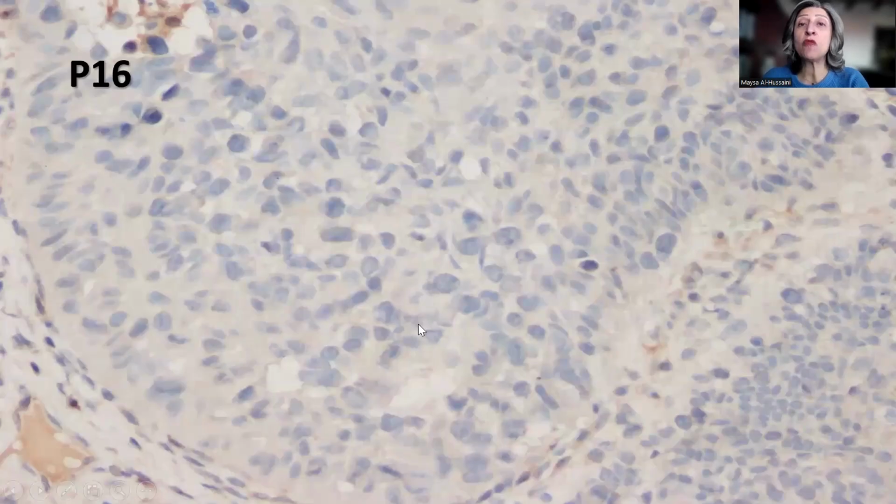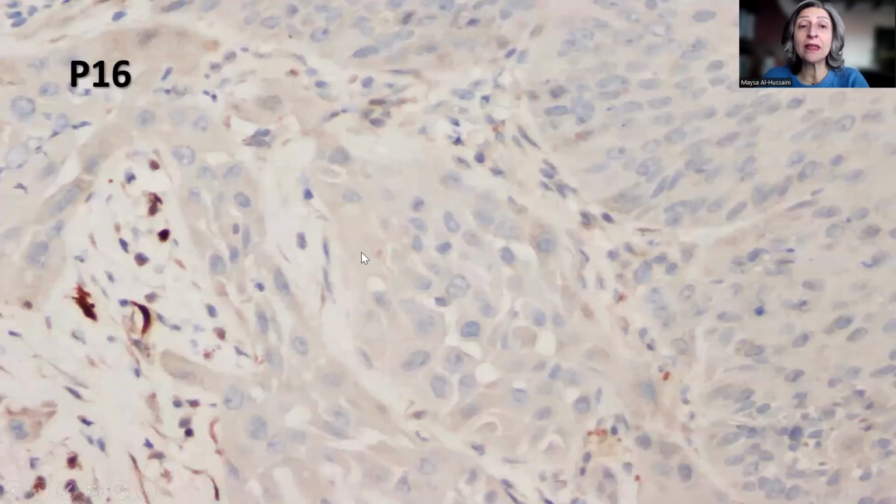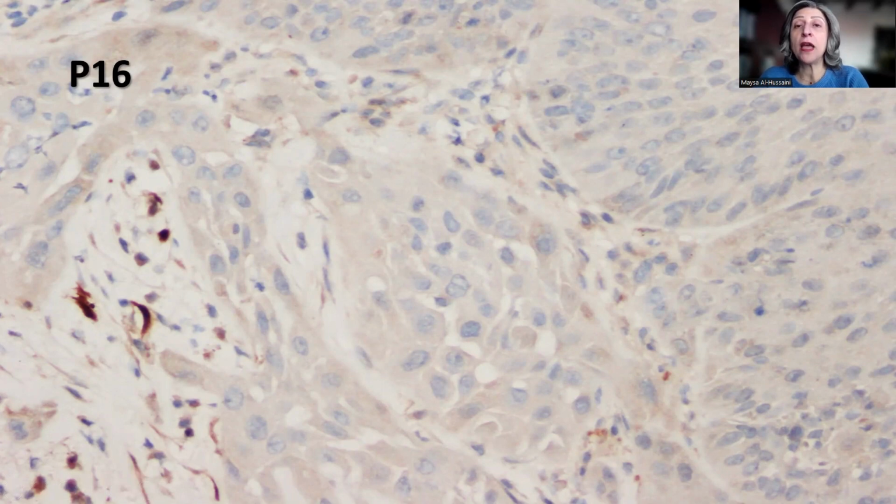becoming more and more recognized as a form of abnormal expression, and there is P16 again showing complete absence of the staining in the carcinoma in situ, but also in the small invasive fronts that are the expression of the early invasive vulvar carcinoma.